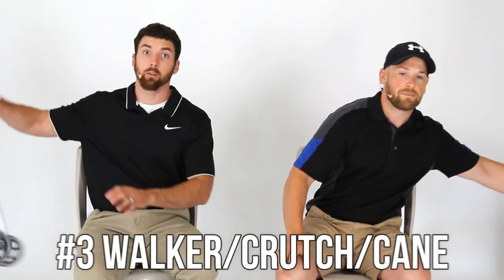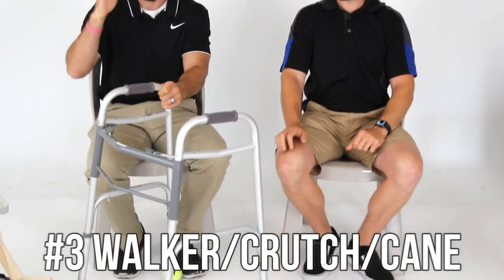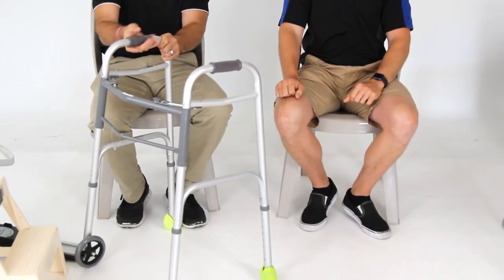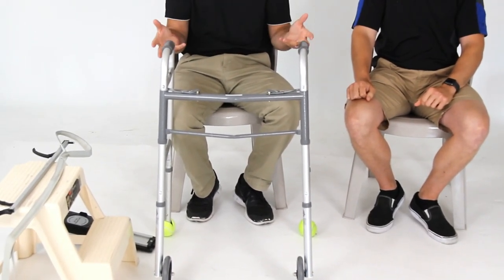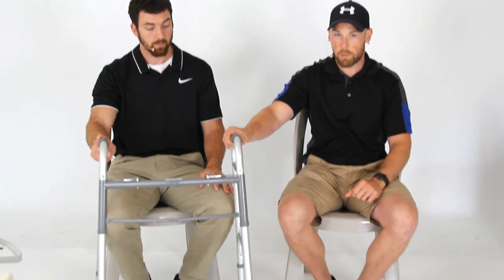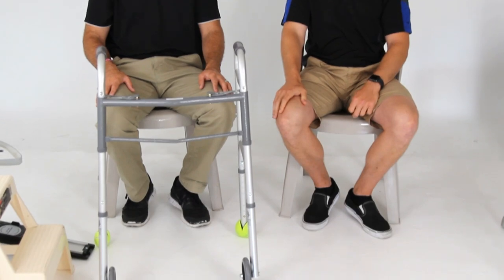Number three: a walker, a crutch, or a cane. This is going to depend on your functional level after surgery, but a lot of people start with a walker. You'll want a height-adjustable walker — something that fits you. You're going to put a lot of weight through it while you have a painful leg. This is a front-wheel walker with two wheels on the front; most people do better with that than a standard walker. Your surgeon will probably tell you what you should be using right away and how long to use it.